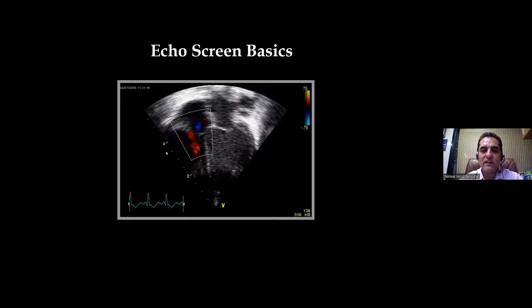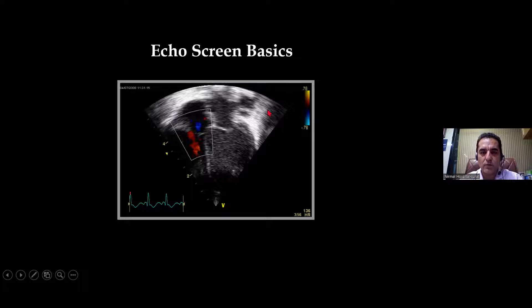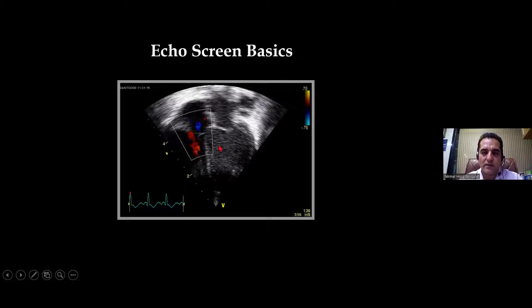When we say it is an optimized view, the heart should be covering around 60% of the sector. This is the whole sector of the phased array or sectoral probe, and 60 to 70% of the area of the sector should be filled with the organ we are concentrating on — the heart.